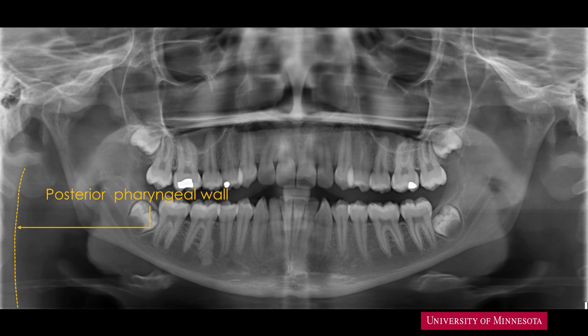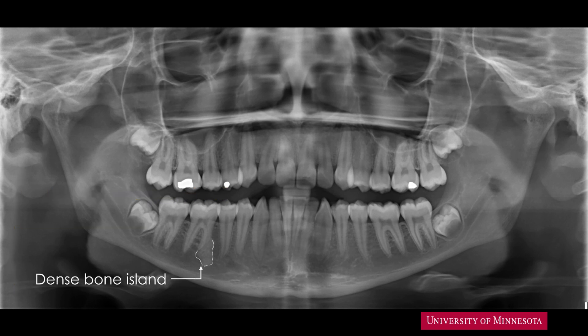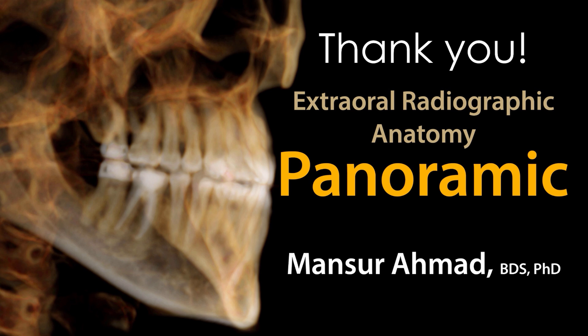Finally, let's talk about the radiopacity on the mesial aspect of the mandibular right first molar. We'll learn more about this in the fall semester, when you will provide a differential diagnosis naming this condition as a dense bone island or idiopathic osteosclerosis, and differentiate it from sclerosing osteitis or periapical cemento-osseous dysplasia. This is the end of the required landmarks as visible on panoramic radiographs.